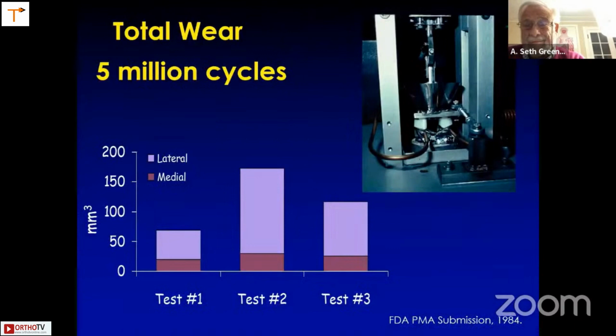Traditionally, tibial insert wear is determined through the use of simulators whose both loading and kinematic pathways elicit wear volumes which are representative of anticipated in vivo articulation. In this regard, multi-station servohydraulic and electromechanical implant simulators are employed. As has been indicated, they require long-term in vitro evaluation, are costly in their enterprise, and unfortunately do not always align with retrieval patterns.